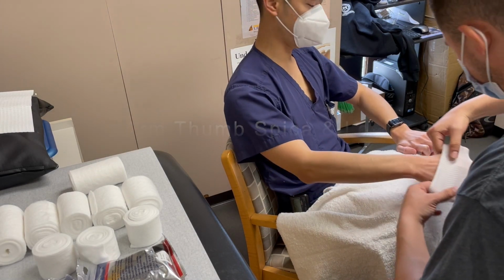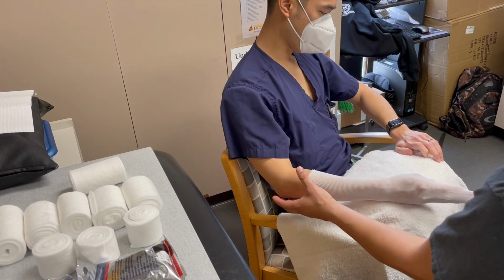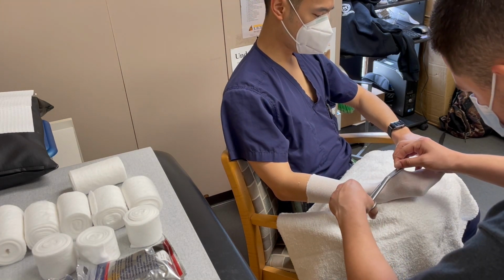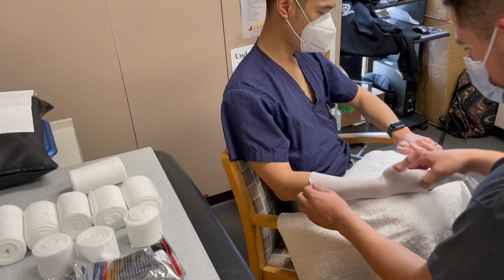In this video, we will be demonstrating how to apply the short arm and long arm cast. We start off with a 2-inch stockinette. We apply it over the area of the cast. Go ahead and make a cut here for the thumb.